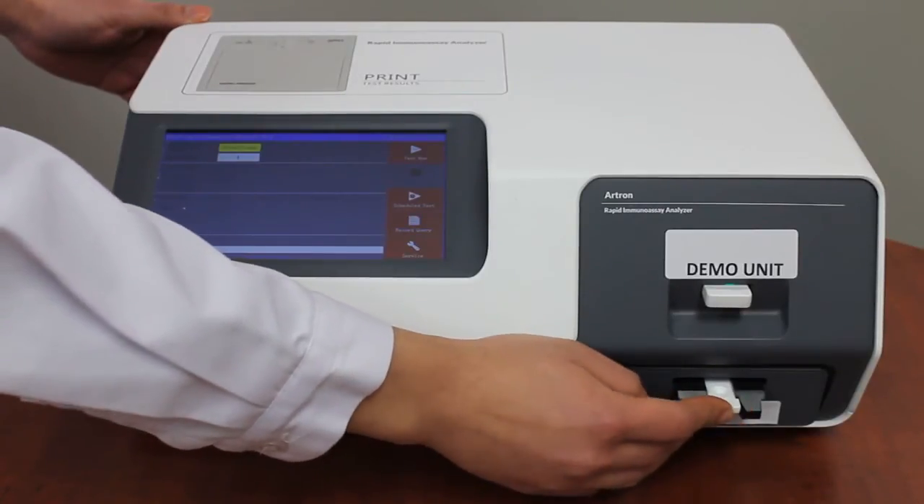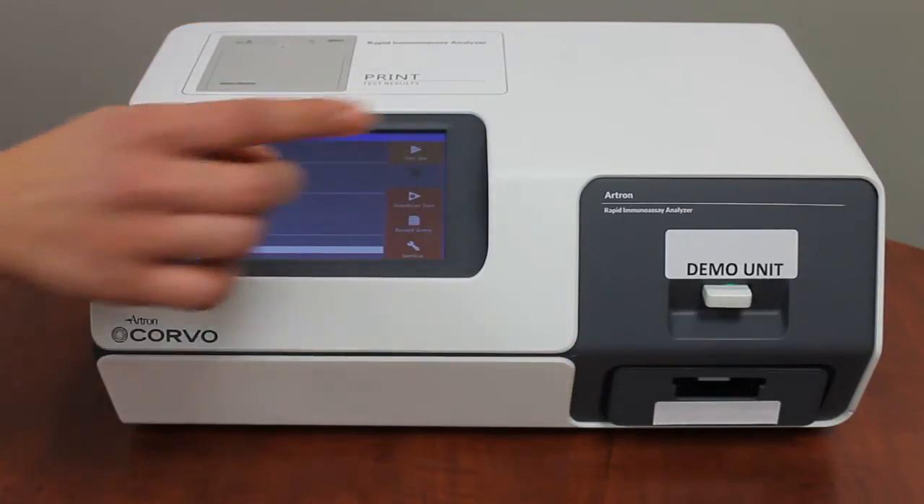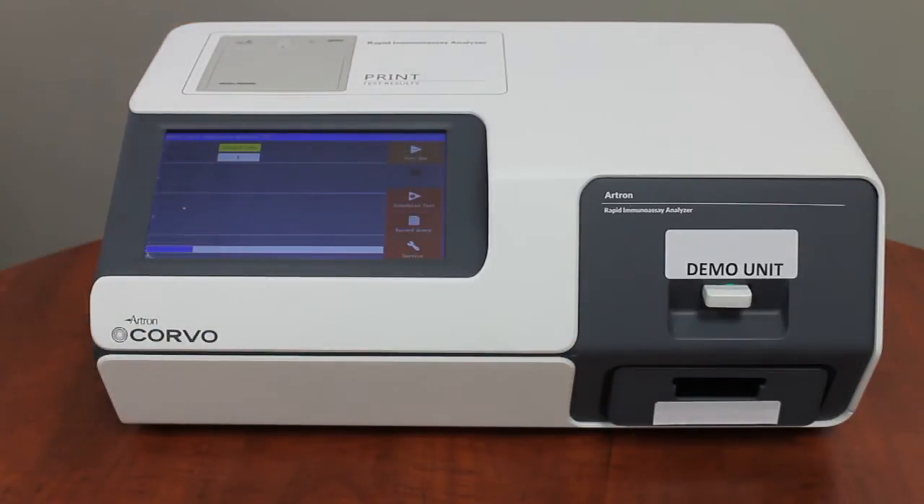To perform the analysis, choose the desired function on the screen. Corvo can perform an immediate or scheduled test depending on your needs. For demonstration purposes, we will now perform an immediate test.